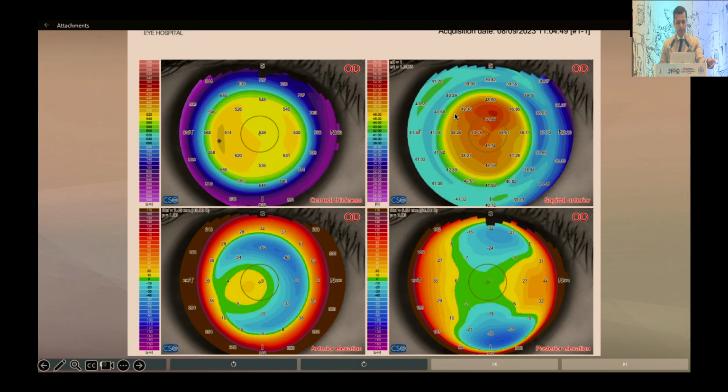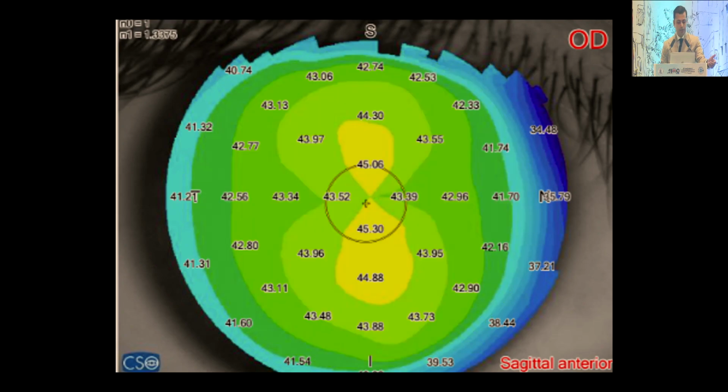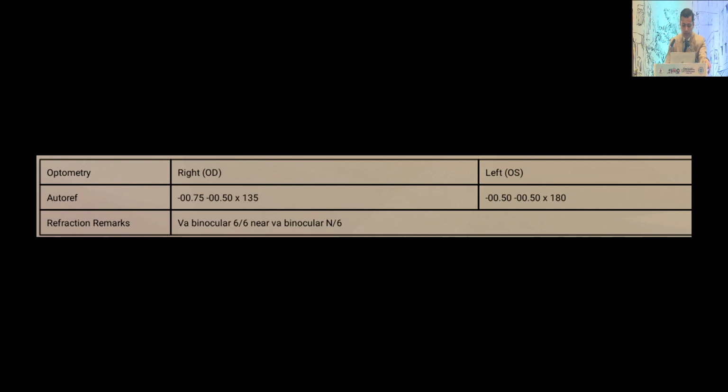So what essentially a hyperopic LASIK will do is it will take out a whole donut-shaped button from this area so as to dissociate the central cornea from peripheral cornea, and it will bump your central cornea so that it becomes like a lenticule in the center. So this is before and this is after of the same eye. This patient is now settled down with minus 0.75 and a minus 0.5, which is a fairly good outcome, and I hope this patient doesn't decompensate, because post-atropinized also the patient was at a 5.5.